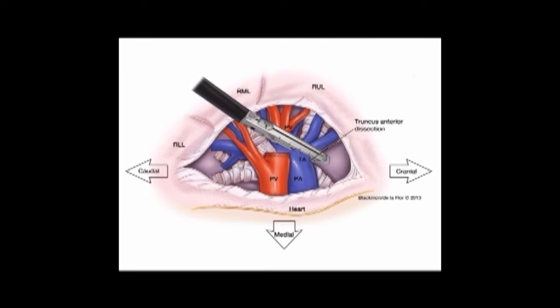For a video-assisted thoracoscopic right upper lobectomy, the second structure divided is the truncus anterior branch of the right upper lobe pulmonary artery. Once the pulmonary vein branches to the right upper lobe have been divided, this is the next vascular structure you should encounter. The truncus anterior branch of the pulmonary artery should be dissected free and separate from the basilar branch. Be sure that you are only encircling the truncus anterior branches and not the main pulmonary artery, which would require a pneumonectomy. Once dissected around the vessels, pass the stapler around this structure and staple and divide the truncus anterior of the pulmonary artery.